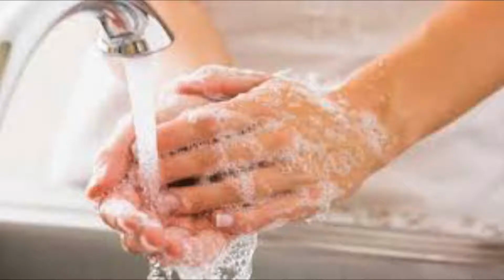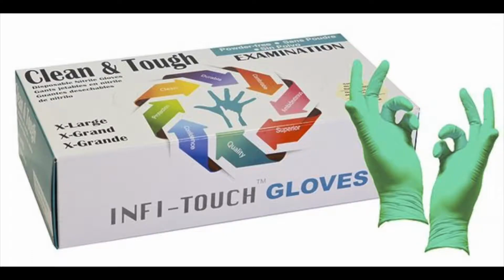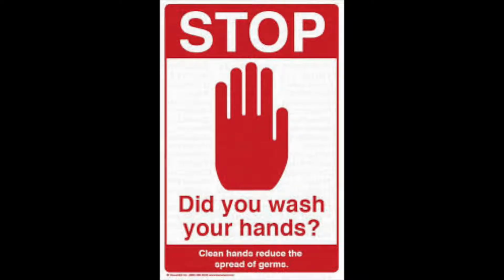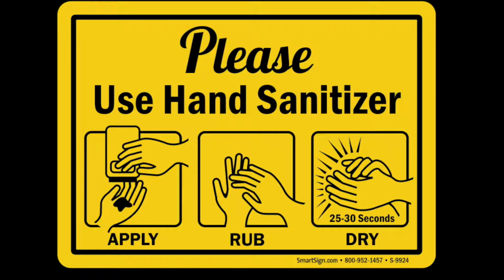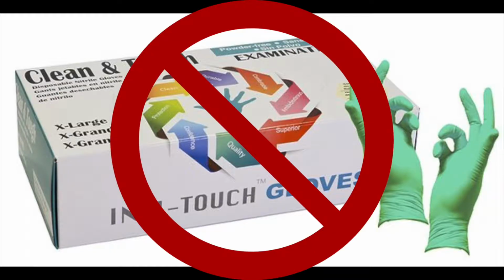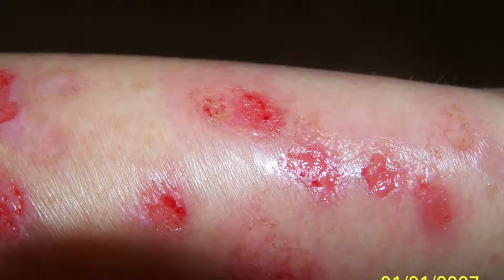The medical assistant should demonstrate knowledge of infection control standards in patient care by washing hands before and after patient contact and demonstrating the use of gloves in patient care when clinically indicated. For the clinical task of EKG collection, the medical assistant should wash hands with soap and water or use a hand sanitizer. The use of clean, non-sterile gloves is not required for routine collection of an EKG unless the patient or medical assistant has open lesions or the skin is otherwise not intact.